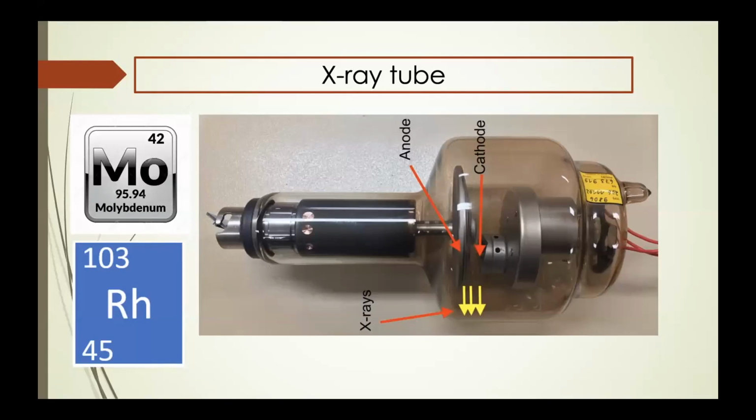They all have reasons why we need that kind of combination, and it affects the quality of the radiation that is emitted. Like I said, I'm not going to go that deep, but you just need to know that this is how an X-ray is produced, and these are the basic components of an X-ray tube.